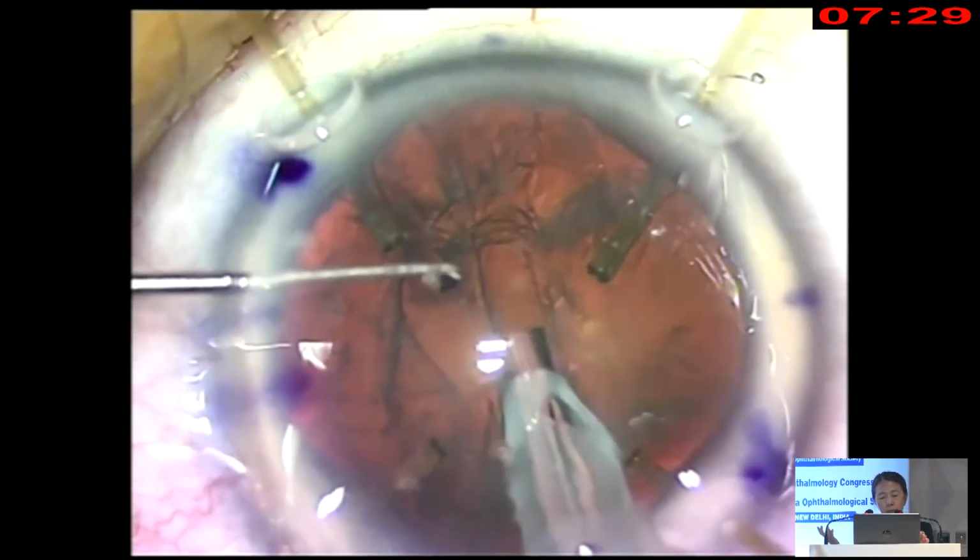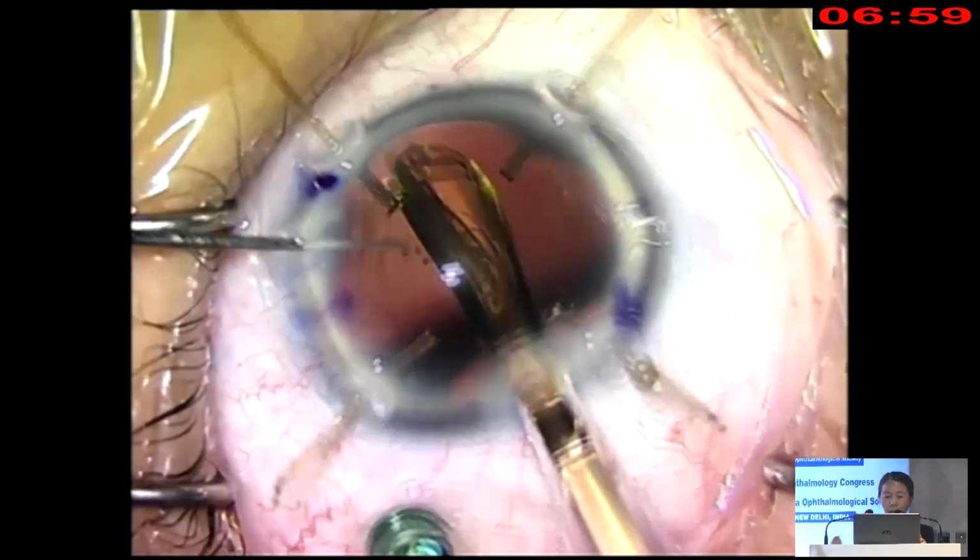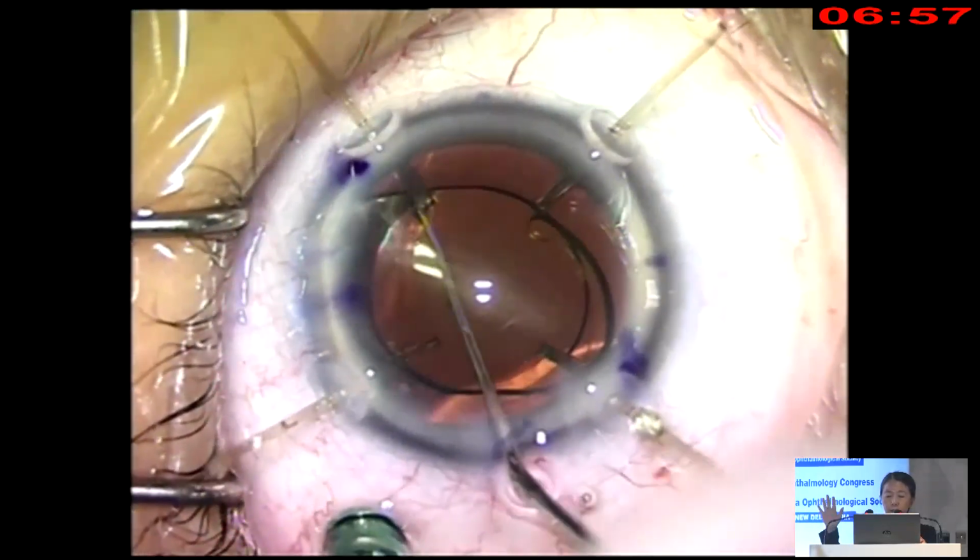And then if you wish some hydrodissection, it's not crucial, because once you've done your visco dissection in the subcapsular plane, 360 degree around, your nucleus can tumble out. Okay, this is doing a cross chop, so you don't have to rotate that much, and you can just tumble your nucleus out. In fact, my parameters can go back to normal because I've sealed the space between the iris and the posterior segment, so no fluid can be misdirected posteriorly, and we don't get vitreous coming forwards because the gap between the two is sealed.